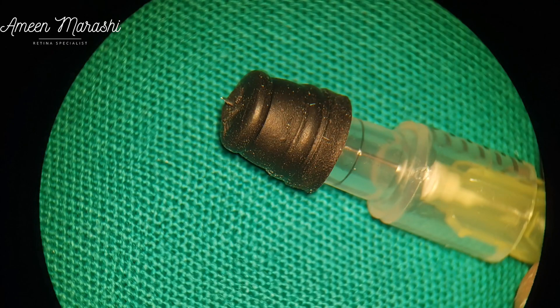Hello, this is Dr. Amin Marashi, Retina Specialist at Marashi Eye Clinic in Aleppo, Syria. This presentation attempts to show how to handmake a suprachoroidal needle, injection technique, and a case report.